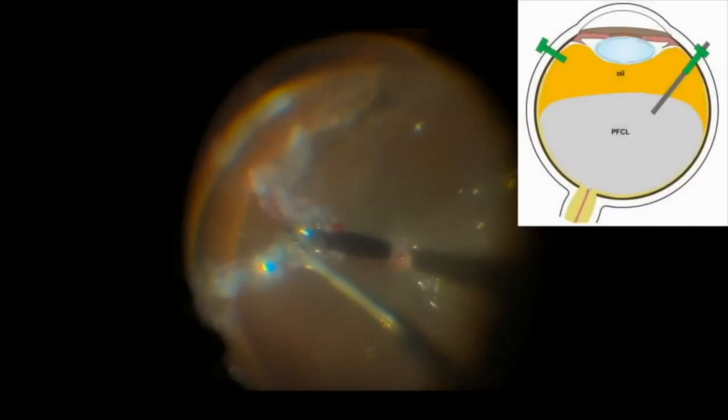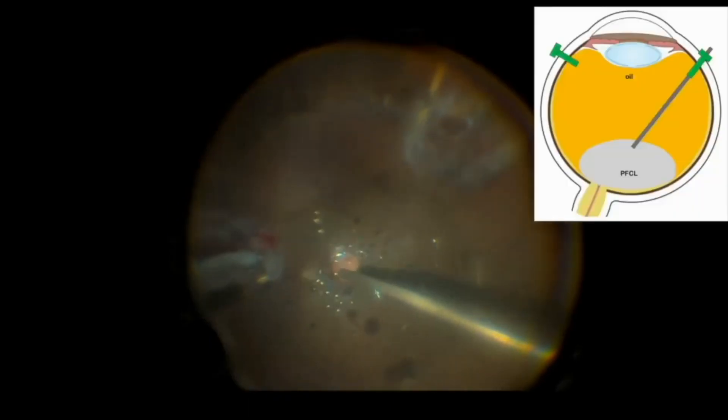After removing the BSS layer, PFCL is aspirated as the silicone oil is injected in the eye, mainly at the edge of the retinal tear. When this is achieved and the edges of the retinal tears are stuck down flat on the choroid, one follows the meniscus backward over the optic nerve to remove the rest of the perfluorocarbon liquid.